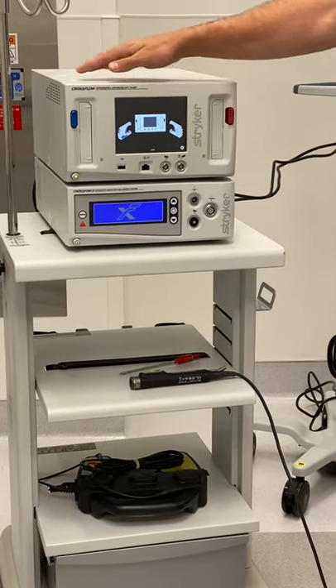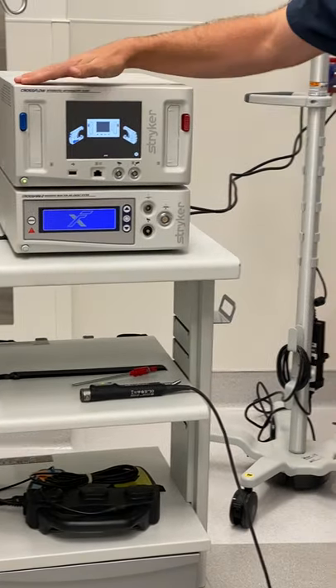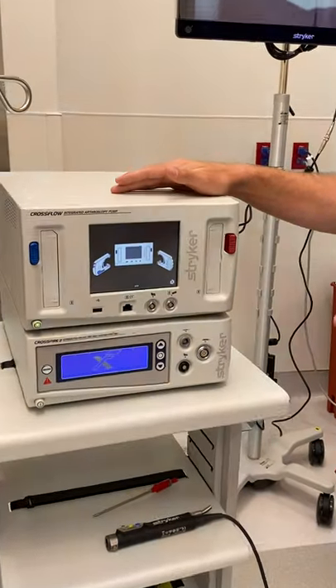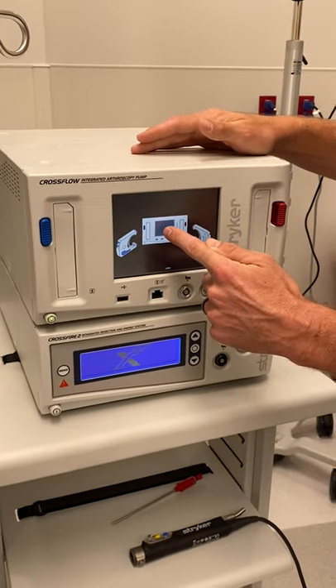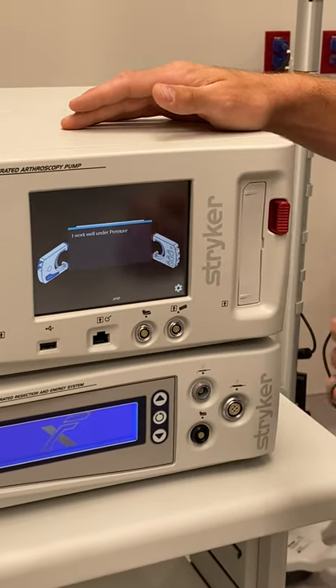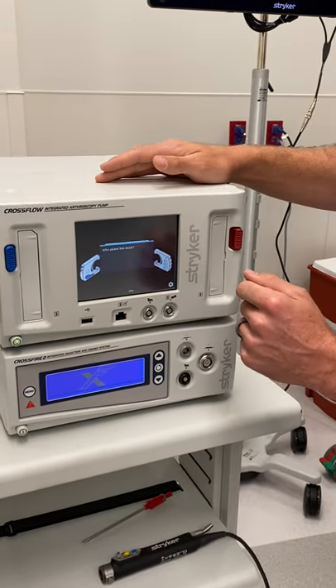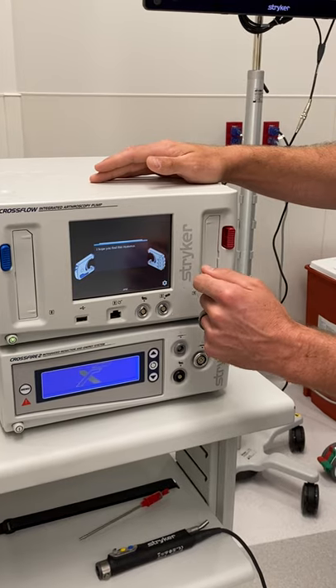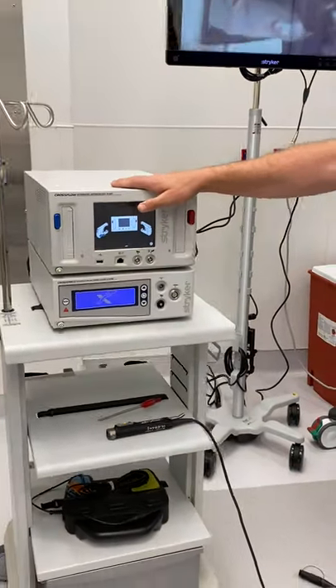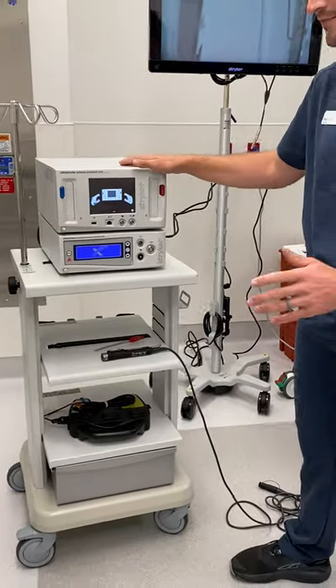First thing I want to mention is: while this is on, this is your little home screen that you're going to see — there's a joke. This thing will tell you jokes. If you click this little center screen, it also says, 'I work well under pressure.' There are some little bits of motivation slash jokes in there if you're going to mess with that.